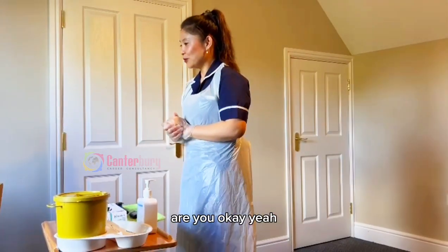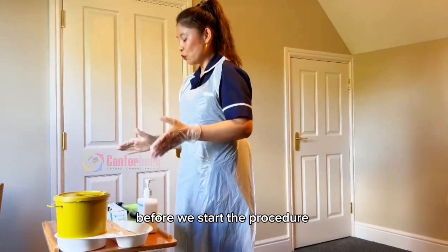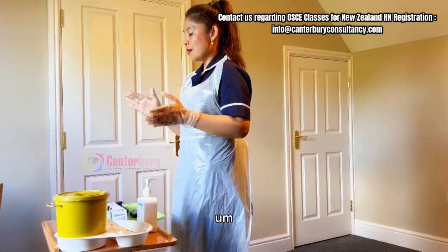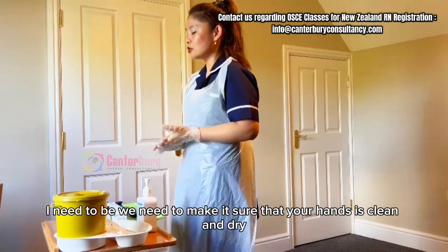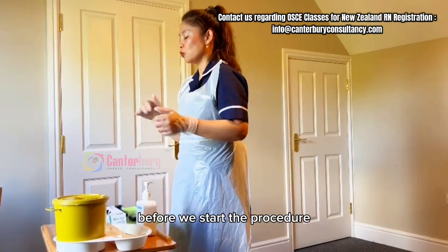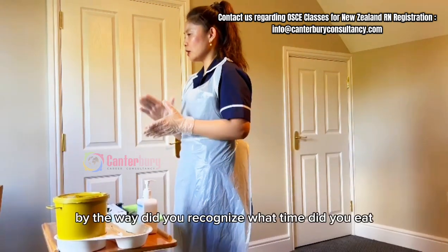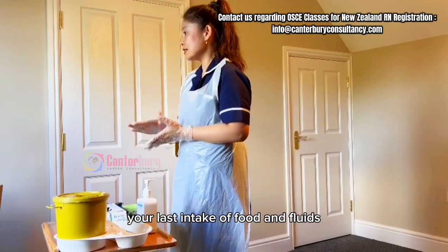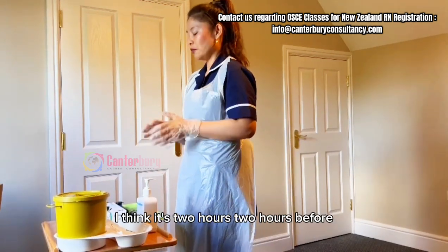Hi William, I'm back. Are you okay? Okay, sorry for the wait. Before we start the procedure, I need to make sure you have washed your hands. Yes, I have. We need to make sure that your hands are clean and dry before we start. And by the way, do you remember what time you had your last intake of food and fluid? I think it was two hours ago. Two hours ago — that's perfect.